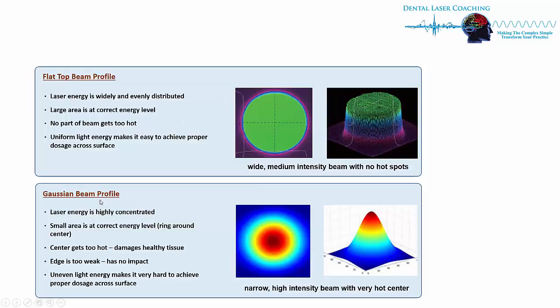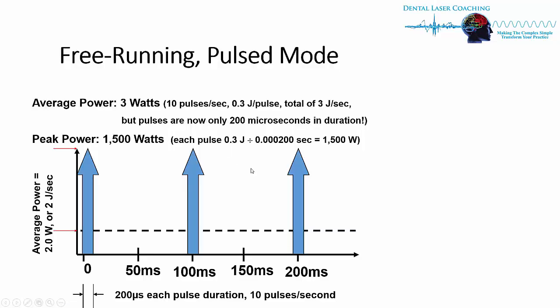Most lasers, you still use this Gaussian beam profile, in which the laser energy is on, but it doesn't come to that flat top, and because it peaks and then it comes down, that can thermally be a little bit hot. So that may be some of the differences in cost. Some of these lasers may use this flat top profile when it's pulsated or hertz.